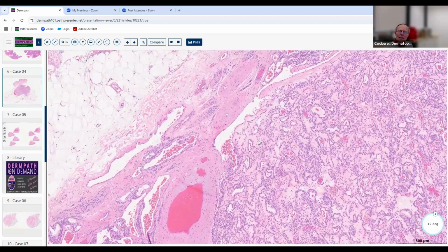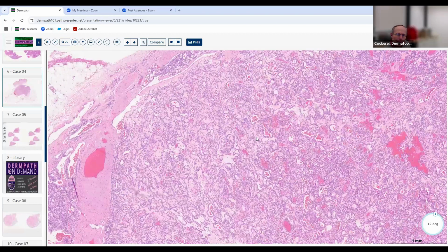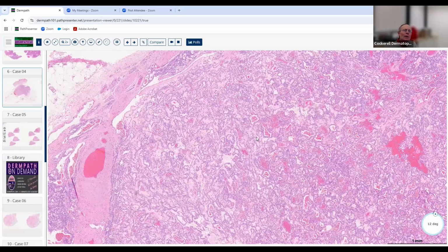Then when you look at a vascular neoplasm, you need to ask yourself, what kind of blood vessels are we dealing with? Capillaries, venules, arterioles? Larger blood vessels? Blood vessels that have thick muscular walls? Blood vessels that are spindle shaped? Because even though we talk about fibroblasts, histiocytes, muscle, and nerve, sometimes blood vessels can develop a spindle cell morphology, like, for example, in Kaposi sarcoma or in angiosarcoma. Are the blood vessels irregular and jagged, or do they look like staghorns, elk horns? Those are important features to look for.